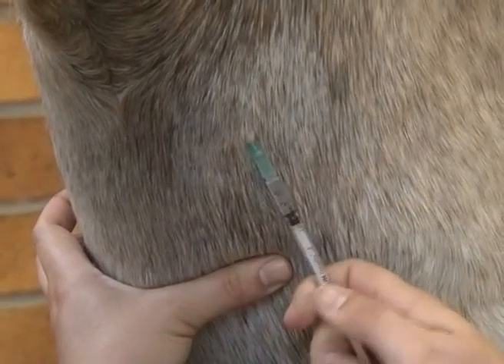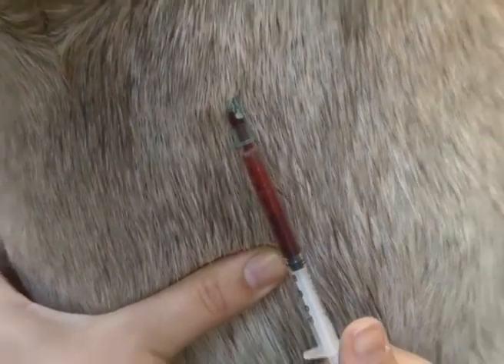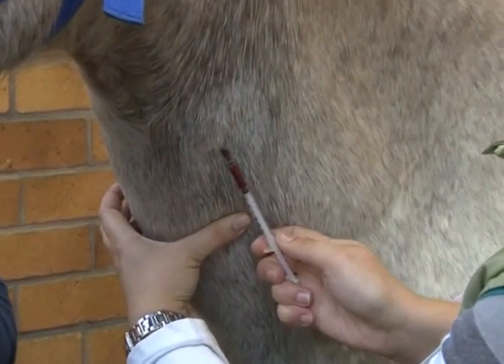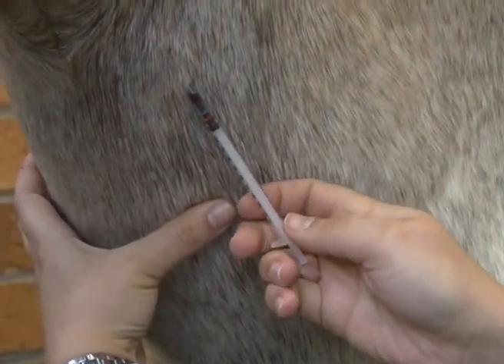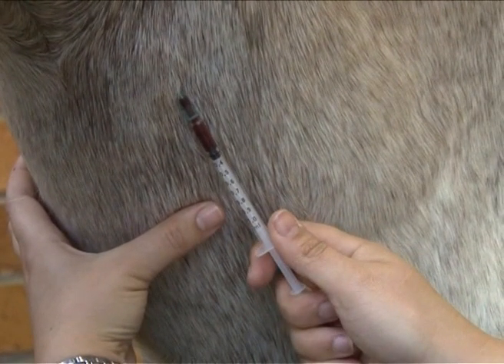Once the vein has been pierced, slightly withdraw the plunger to check if the needle is still in the vein. Blood should appear in the syringe. When injecting, the plunger should be depressed slowly. For blood collection, insert the needle by following the same procedure, then firmly push the vacutainer into the piercing needle.